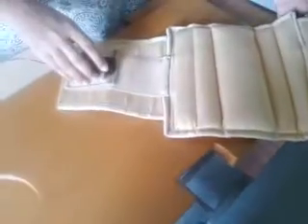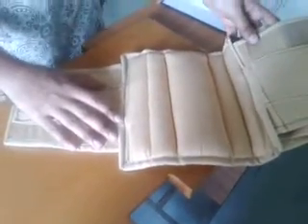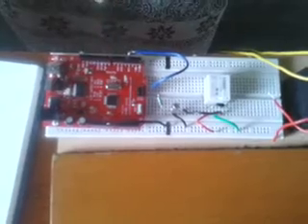The main component which comes in contact with the patient is the load distributing band. The distributing band is used to deliver the chest compressions. It is an adjustable strap that covers the entire rib cage and pulls tight around the chest. It employs thoracic compressions because it produces higher blood flow compared to CPR consisting of sternal compressions only.